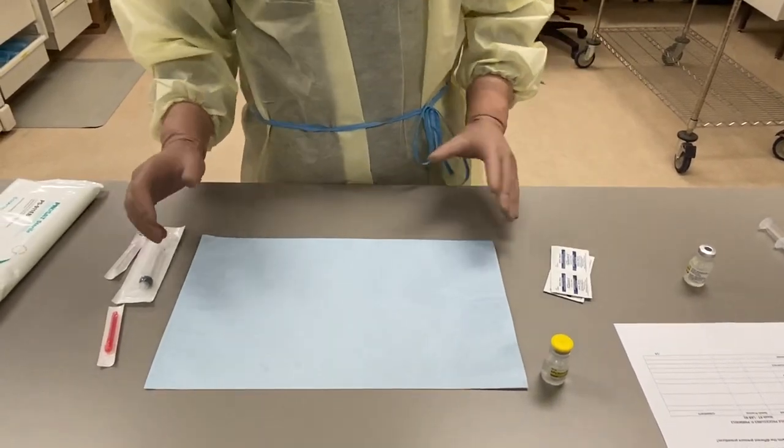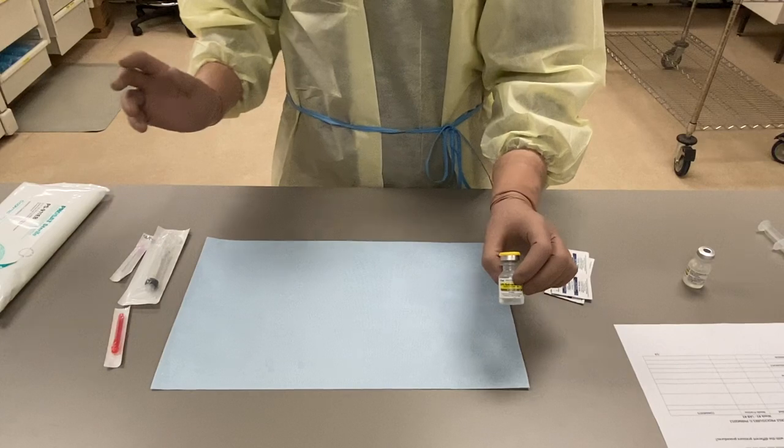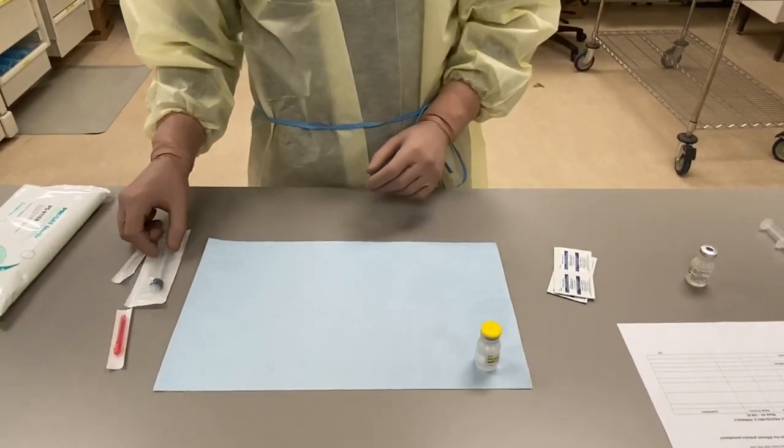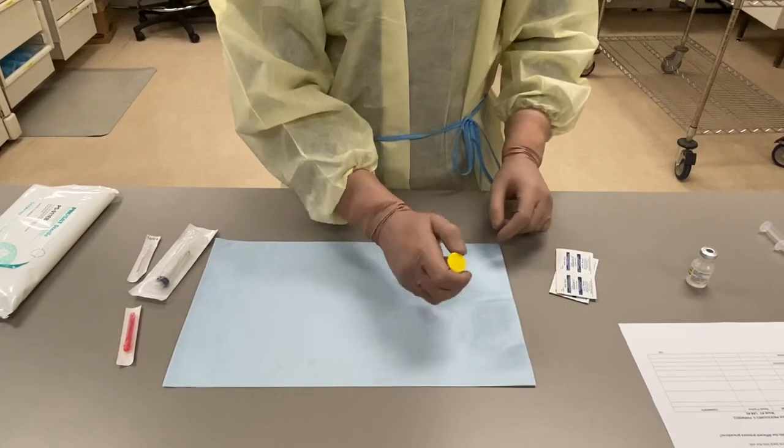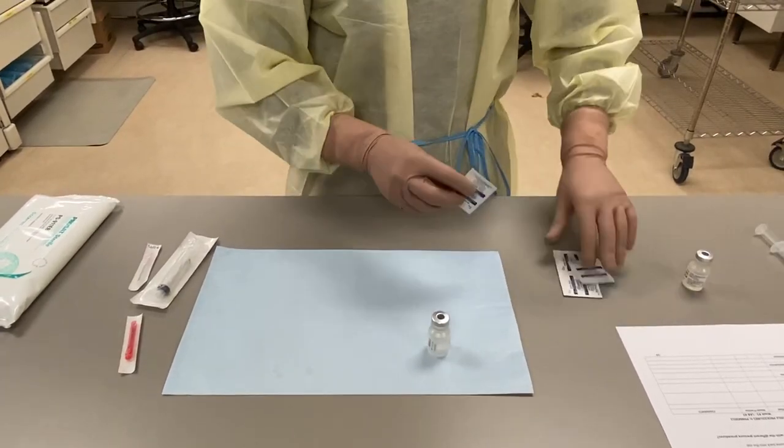Alright, so for our last one, we're going to do negative pressure again, assuming that everything's been cleaned and put into the hood. I'm going to swab my cap again.